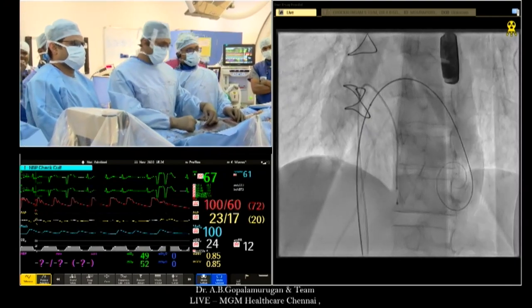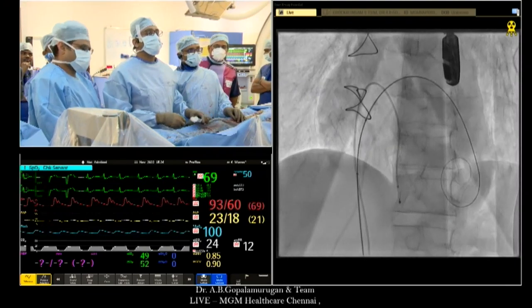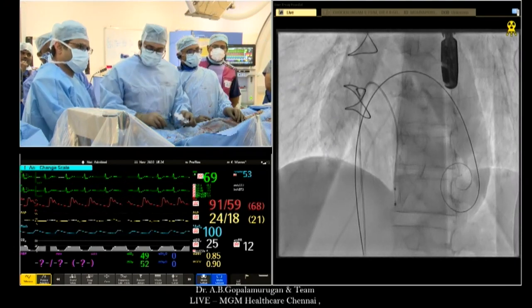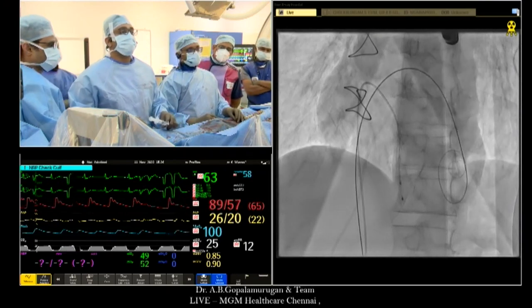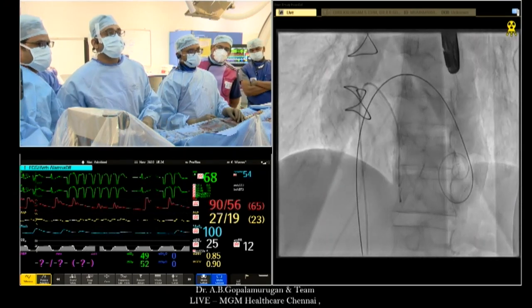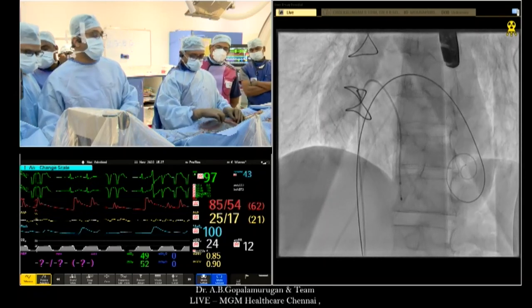Against the flossing. Yeah. The flossing will make the trajectory easier. If flossing fails, perhaps you have to change the strategy. But on the negative side, you have a chance of embolism. Because with flossing, you're still going to take the balloon, or wing the balloon, through the valve, and you could knock off pieces completely off the valve if you take a winged balloon. So that's why I don't floss it, I don't take it.